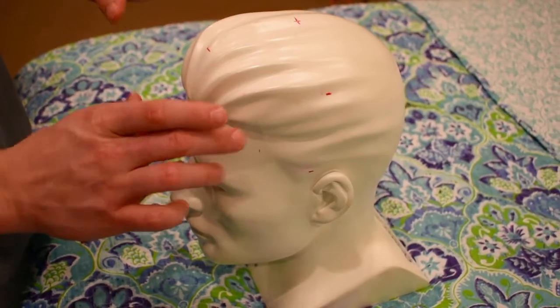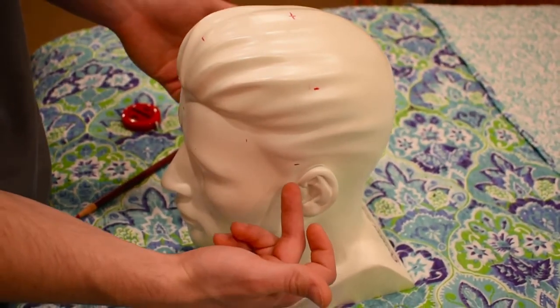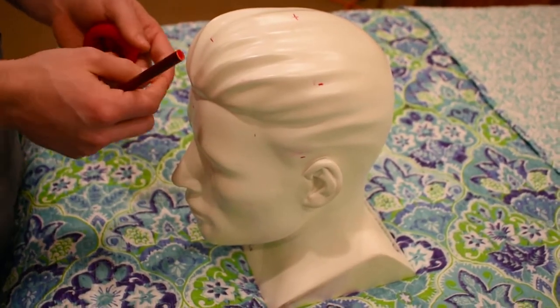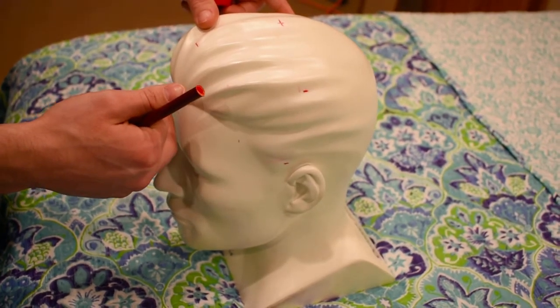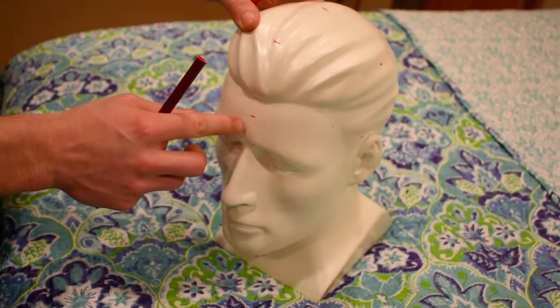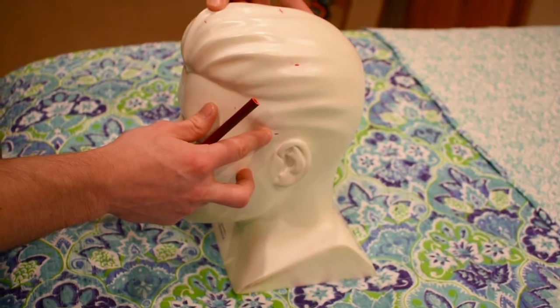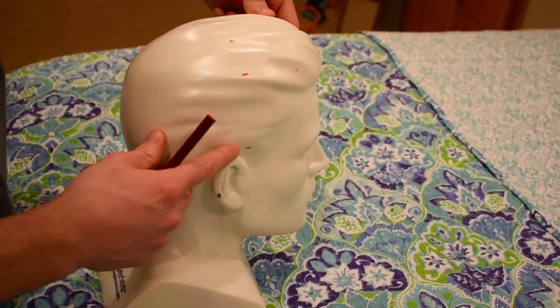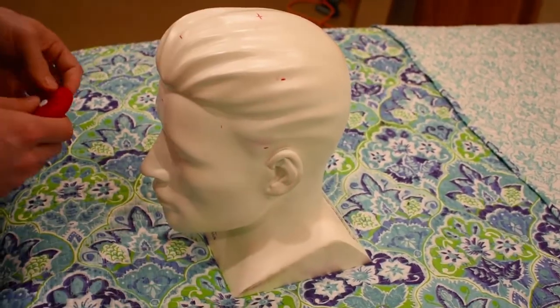Okay, so now that we have our measurements from Nasion to Inion and from the left and right preauricular sites, we're going to measure the circumference of the head through the areas where we marked up 10%, or 3.8 centimeters. So that's going to be FPZ, T3, OZ, and T4. We're going to mark the circumference through. So I'm going to go ahead and do that.